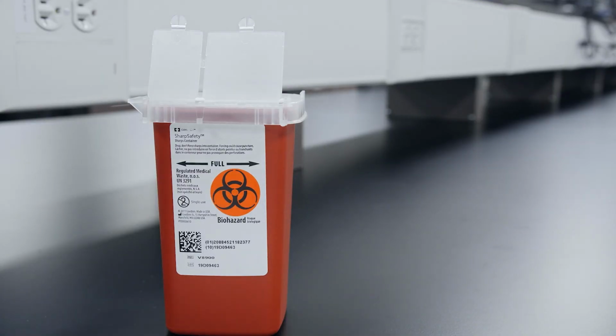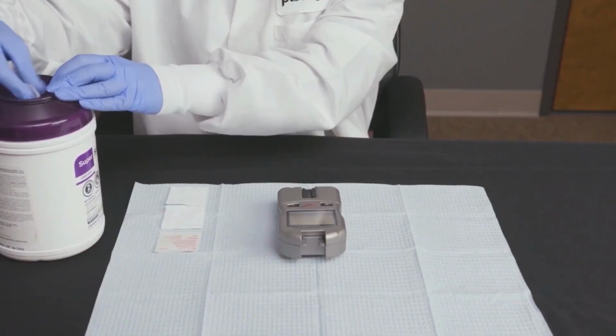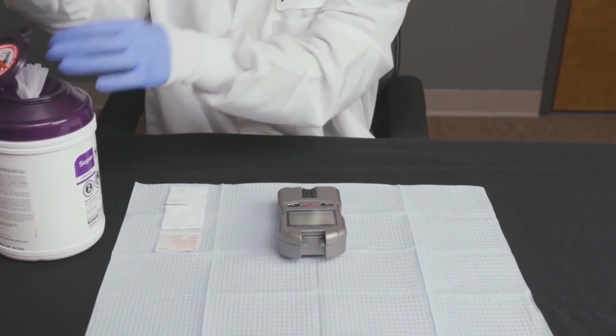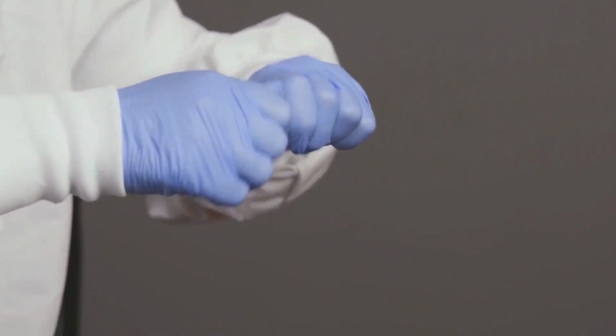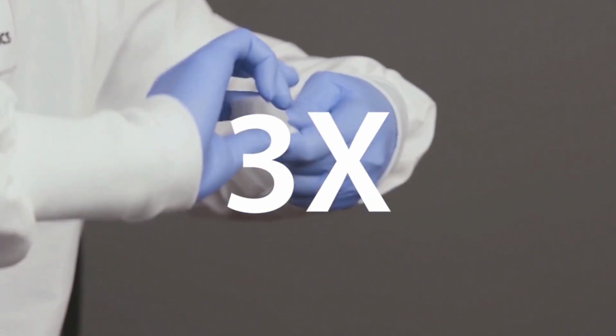container. To help protect your patients and yourself against blood-borne pathogens, you must fully clean and disinfect your CardioChek Plus analyzer between each patient test and before storing. First, clean the analyzer. Take 2 Super Sani-Cloth disinfectant wipes out of their container. Fold the wipes in half and forcefully twist them at least 3 times to wring out excess liquid. Set one wipe aside.